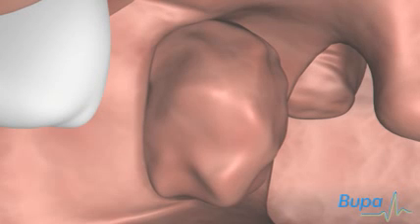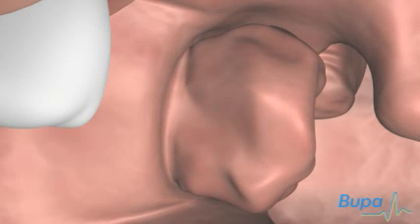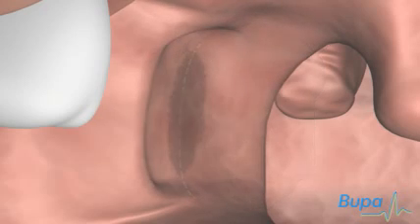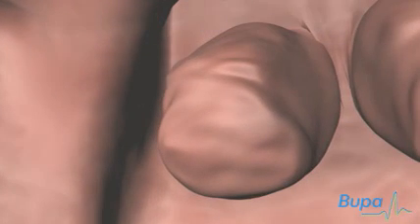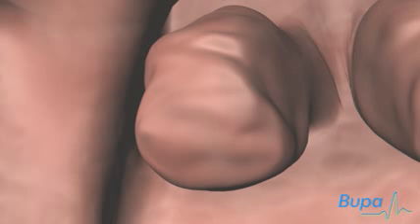Specially adapted instruments are used to remove the adenoids and tonsils. Here we show the tonsils and adenoids being removed.